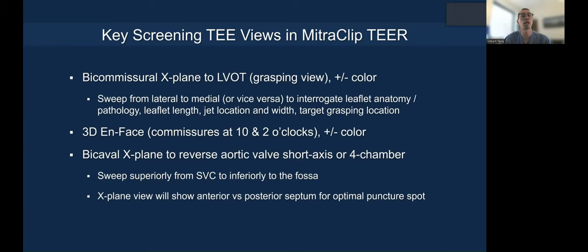Finally, you need to do a bicaval X-plane to reverse aortic valve short axis or reverse four-chamber view, sweeping superiorly from the SVC down inferiorly to the fossa. The X-plane view will show anterior versus posterior part of the septum to identify your optimal puncture spot. This final view for transeptal access is critical.